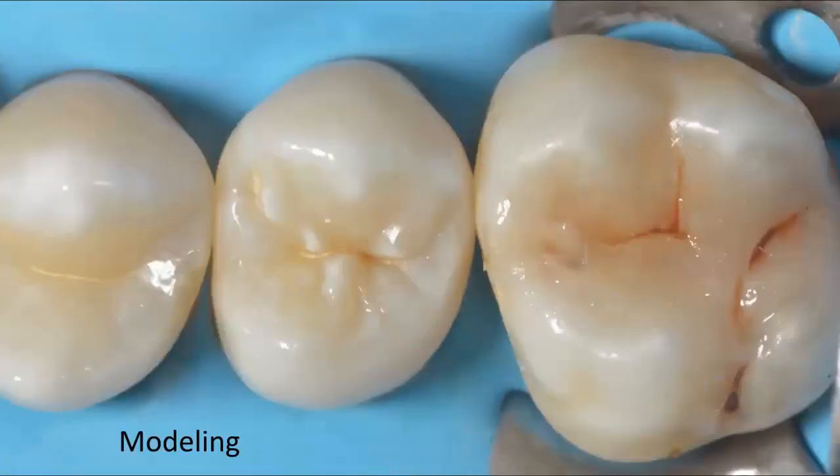So this is the modeling. The modeling includes, as the doctors here explained very well, different steps like the pizza technique, the incremental technique, and the successive cusp build-up technique. You have to build the cusp step by step in the successive cusp build-up technique. In the incremental technique, you layer it in increments.